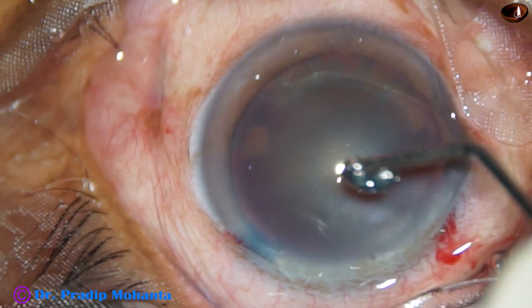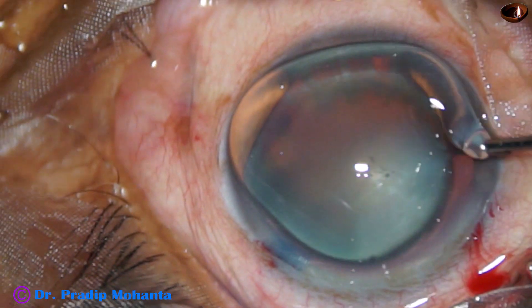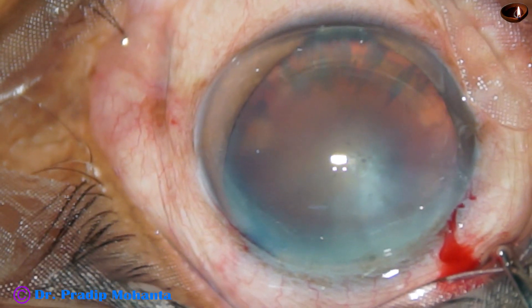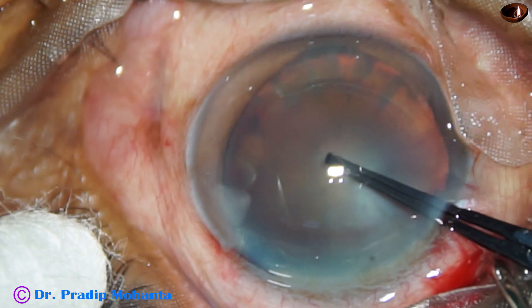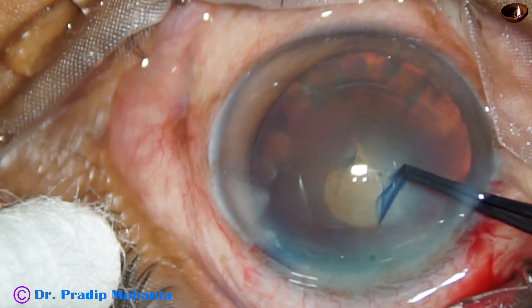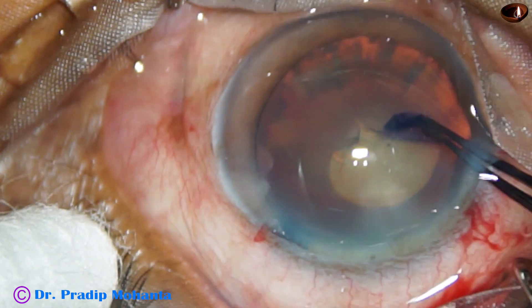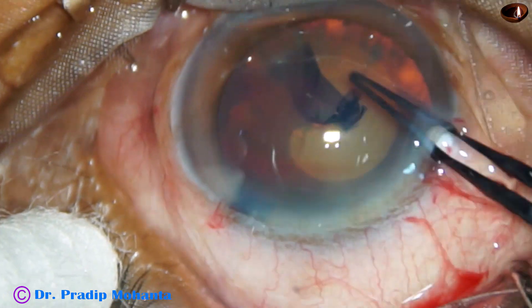And now capsulorhexis with utrata forceps. HPMC is applied over the cornea for better visibility. The utrata forceps is introduced, the anterior capsule is nicked, the capsular tag is traced, held, and with clockwise movement an adequate size rhexis is being done.